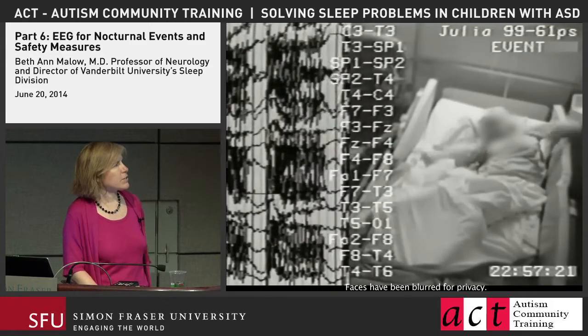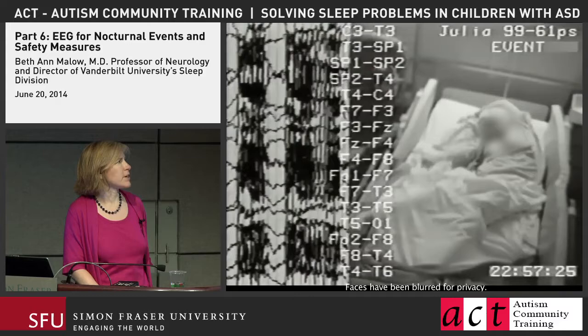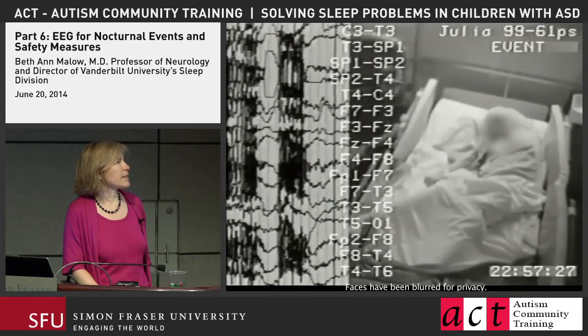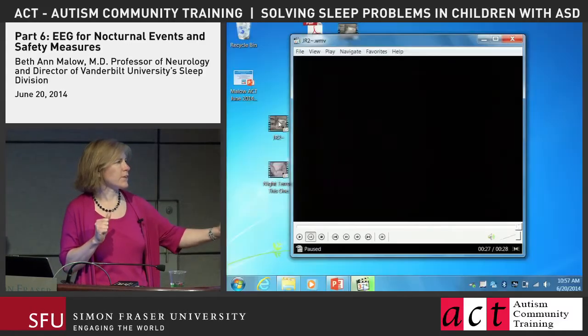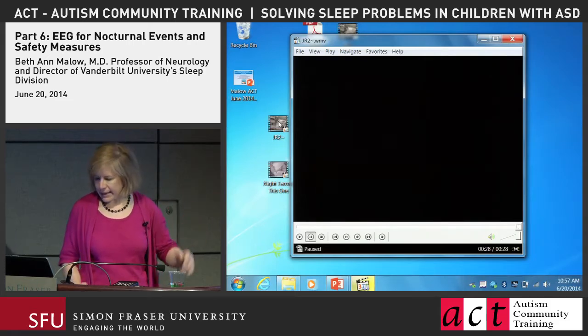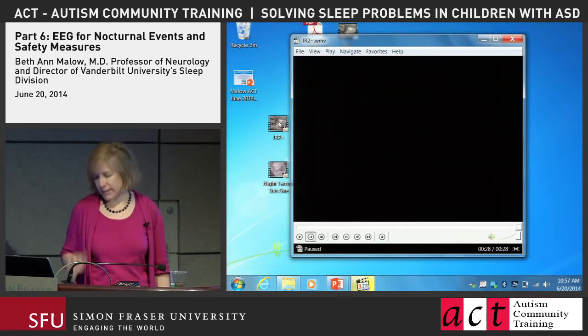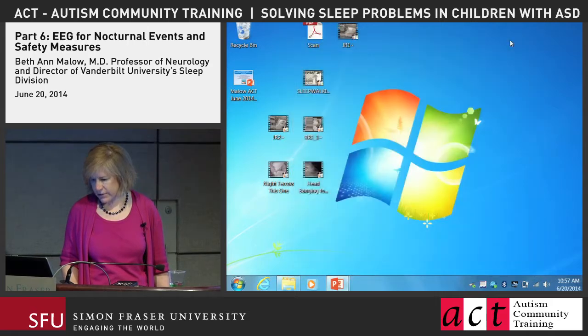And this is a seizure because the same parts of the brain are firing every time. And there's clonic activity, there's the stiffening. So even without the EEG, that would be highly suspicious of a seizure. And that's something we can record in the lab. There's also something that parents can record on their phones, and then we can decide if we need to bring the child in for a sleep study with a full head EEG.